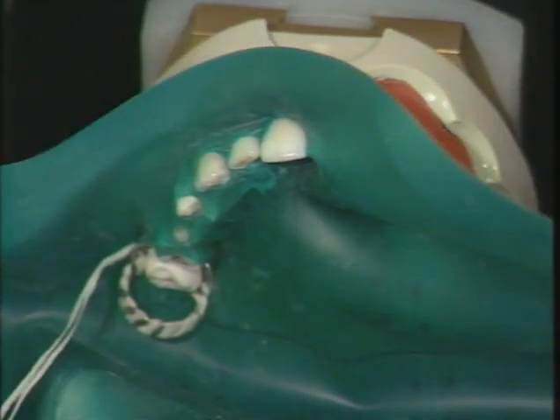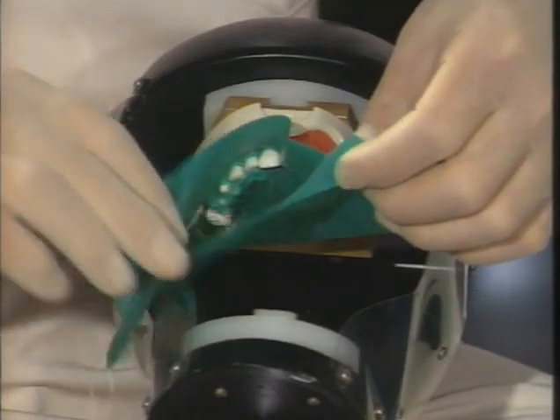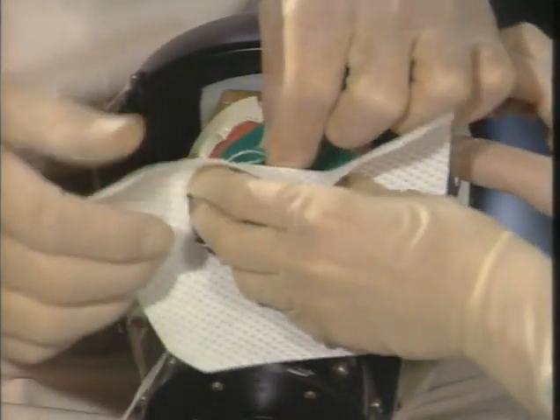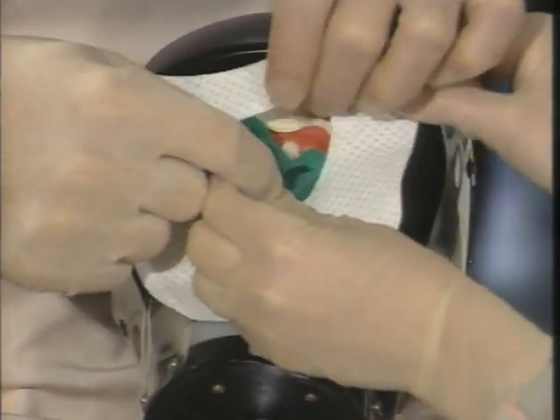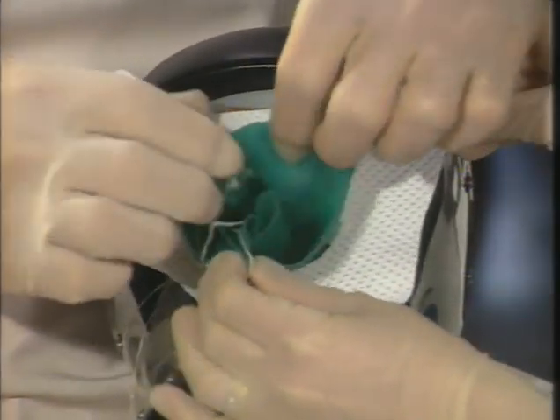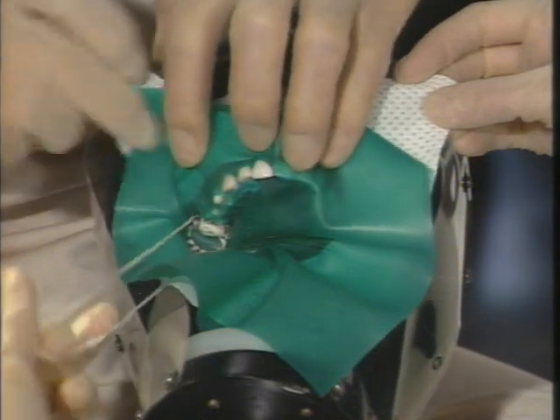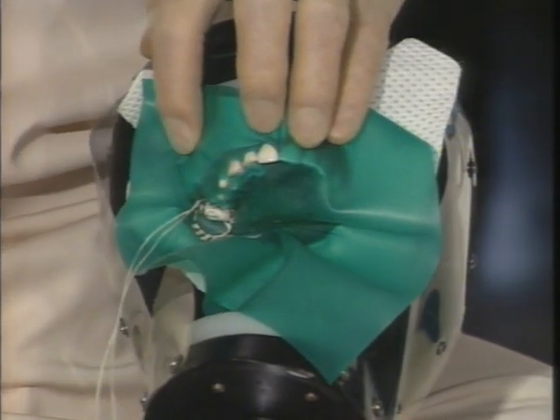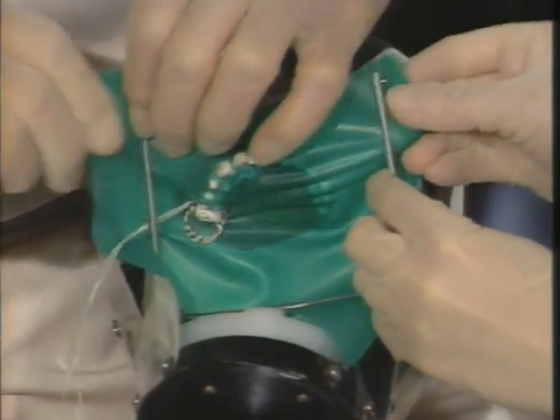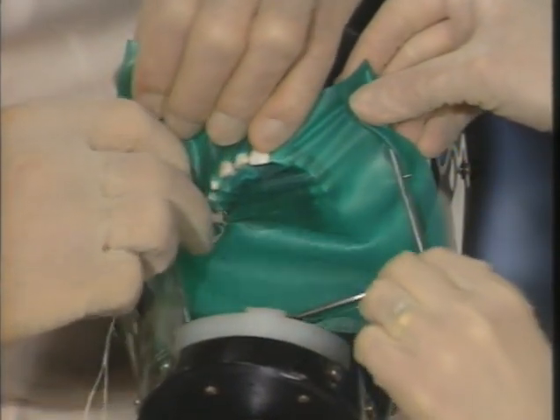It's at this stage in the live situation that Vaseline is placed around the corner of the patient's mouth. The napkin is put on and the frame is put in position. Chris is taking the napkin, passing it over there for me. She's collected up the dam. We'll now put the frame into position and make sure that that floss is out of the way. This again becomes a four-handed procedure so that it can be done quickly and efficiently.